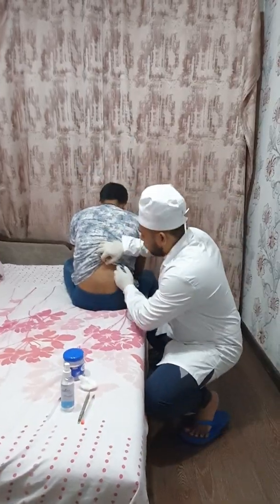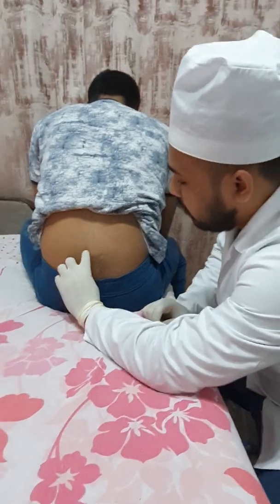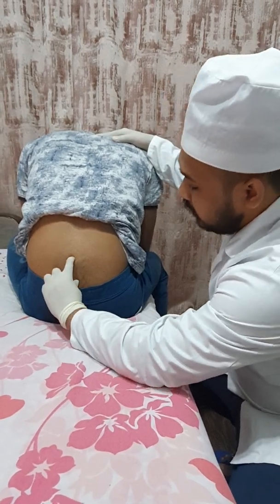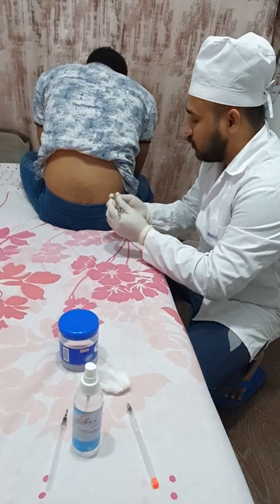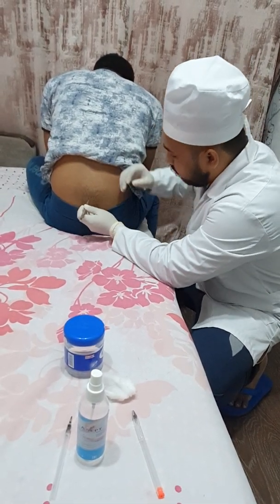Basically the CSF is obtained in the lumbar region, between lumbar fourth and fifth, and I'll ask the patient to lean more down to increase the space between them, and I will penetrate the CSF needle through the space between lumbar 4 and 5.